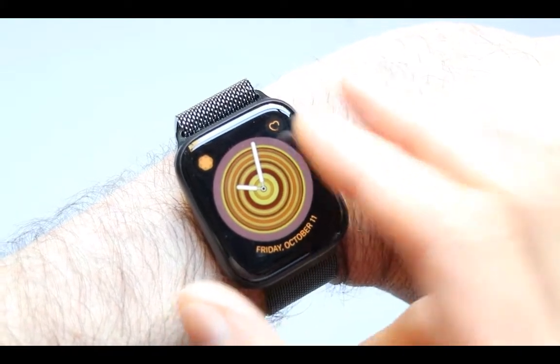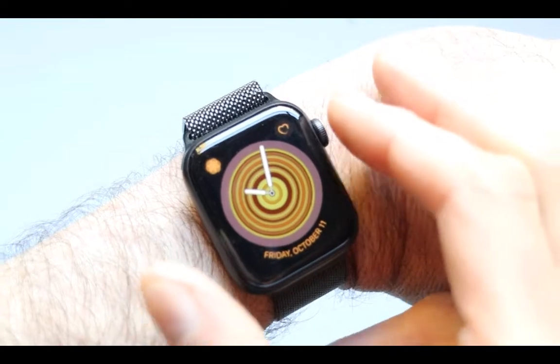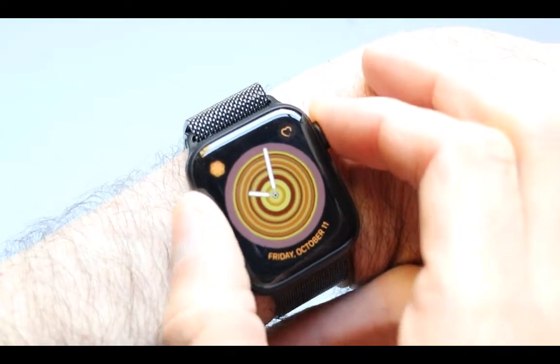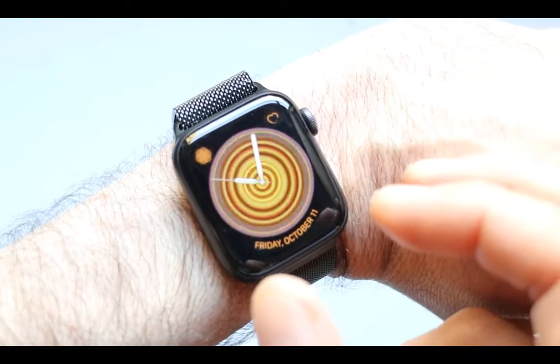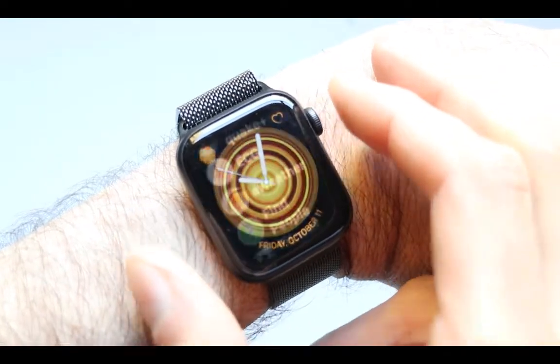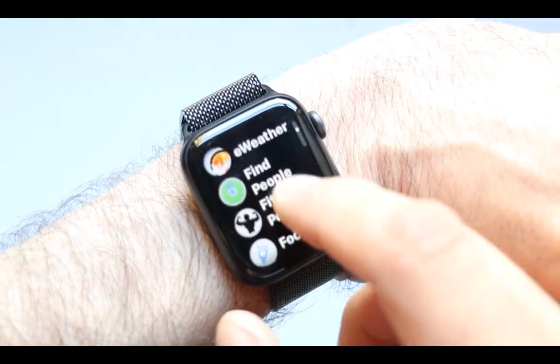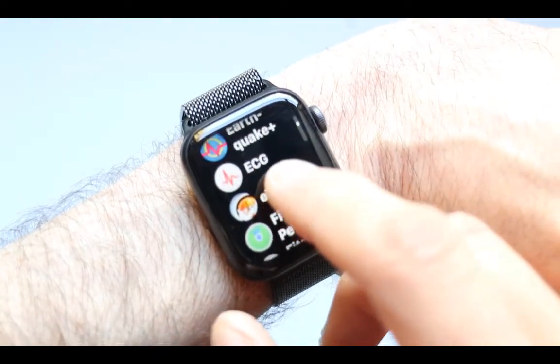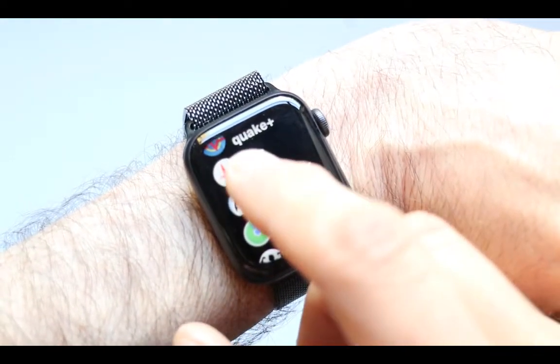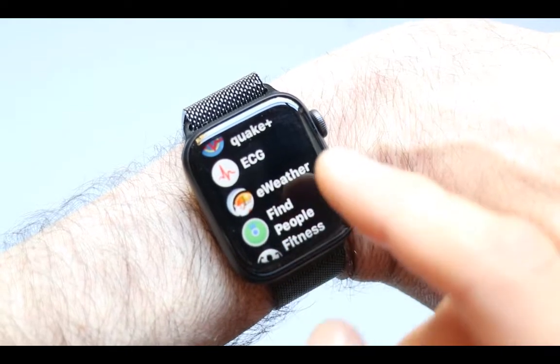Not sure if your watch actually has it. To find out, all you have to do is go to your menu, scroll through it, and see if you have an app that says EKG right in here.